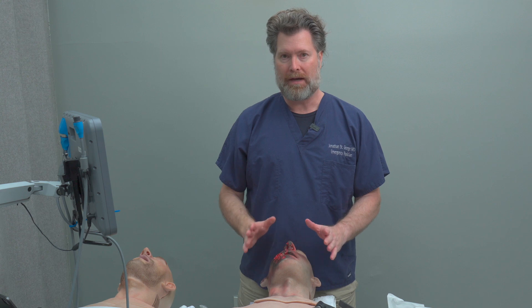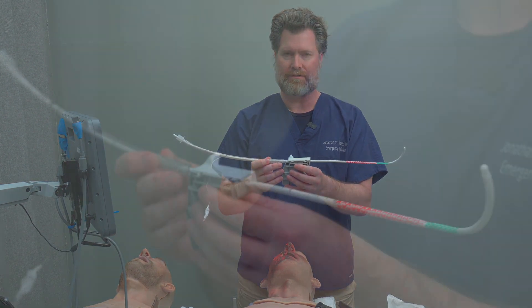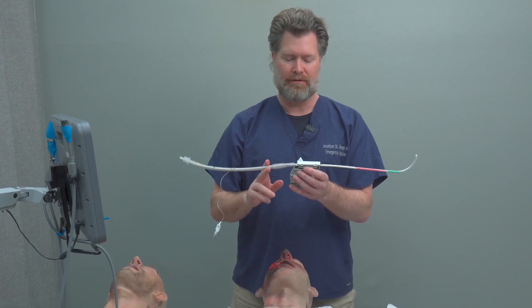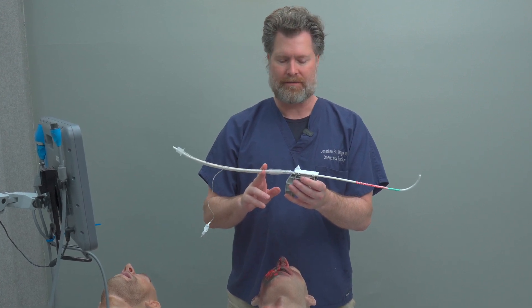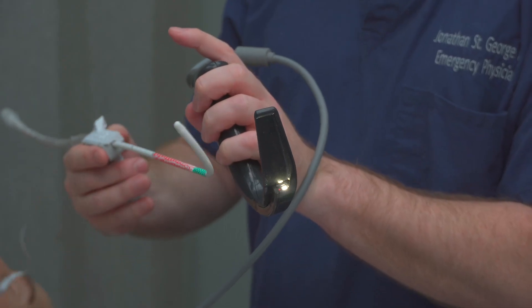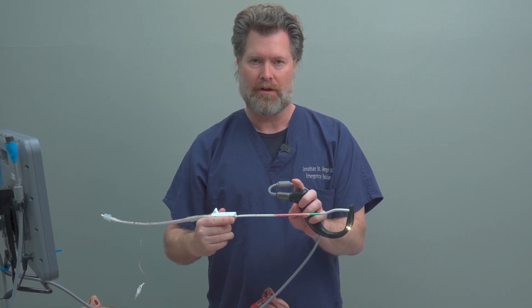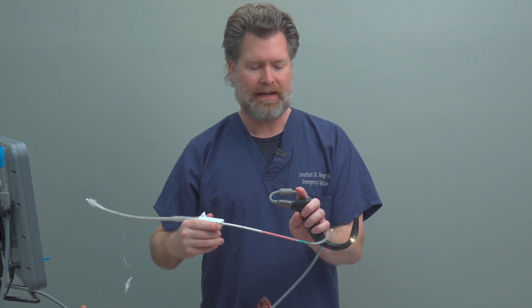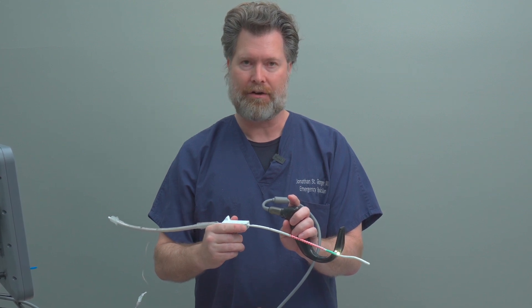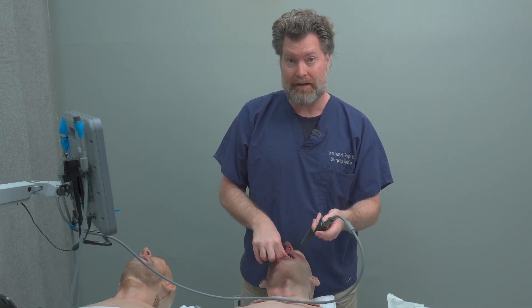Recently, new tools have come to market — articulating bougies, or articulating tube introducers. This one is the Total Control Introducer, my favorite go-to device for these patients. Because of its articulation, I can use a hyperangulated blade, then navigate the bougie delicately through swollen cords without banging into any tissue at all. It allows me to navigate along the hyperangulated blade to the glottic opening, then drop it to navigate down the secondary curve into the trachea. Let me show you what that looks like with the hyperangulated blade on the GlideScope.